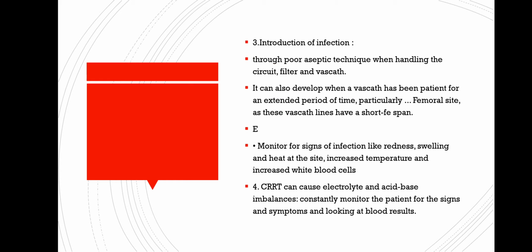CRRT can also cause electrolyte and acid-base imbalances constantly. Monitor the patient's signs and symptoms and look at the blood results.